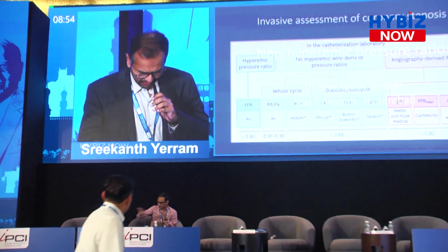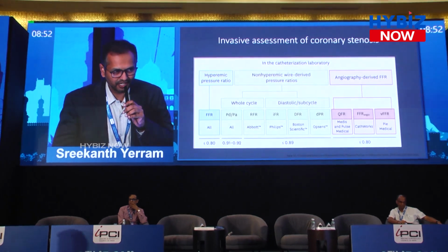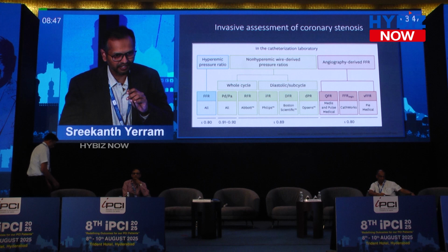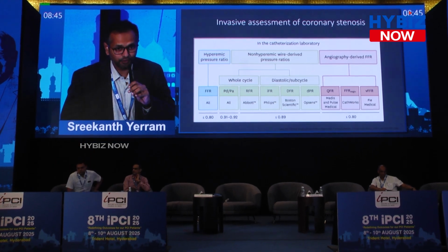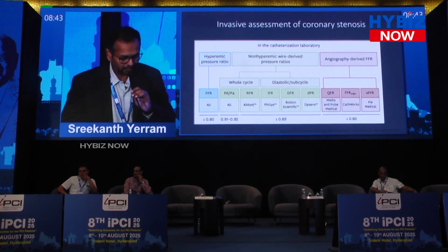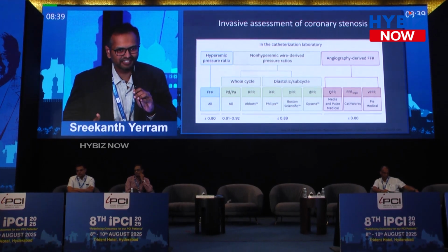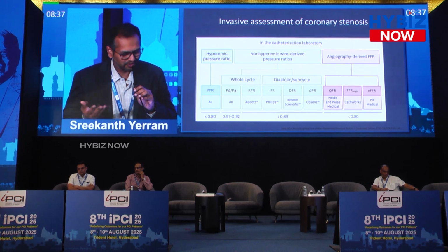I'm going to add to FFR now. And it's always, we wonder why we do so many fewer FFRs when compared to so many PCIs in our country or the world over. So this is a question which we ponder over all the time. And one of the reasons is because FFR is a little cumbersome to do, maybe expensive. We'll see all of that.